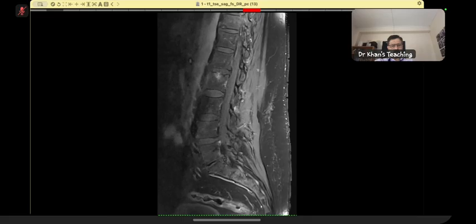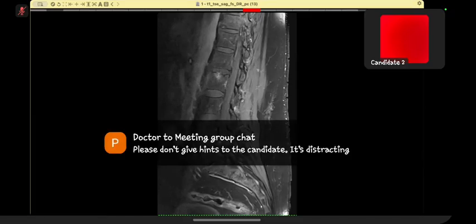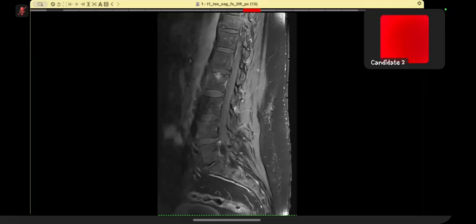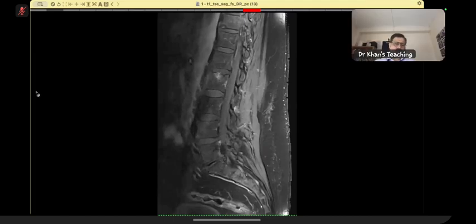So I think the conclusion is that this is likely an acute Schmorl's node causing the pain, and the other differential would be a spondylodiscitis. I have to correlate with the constitutional symptoms for the patient. Okay, thank you.